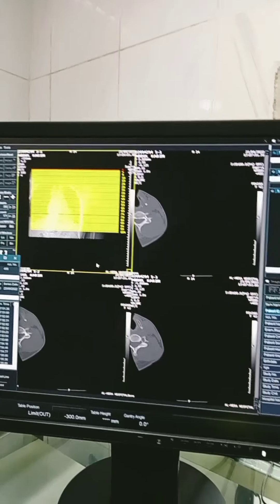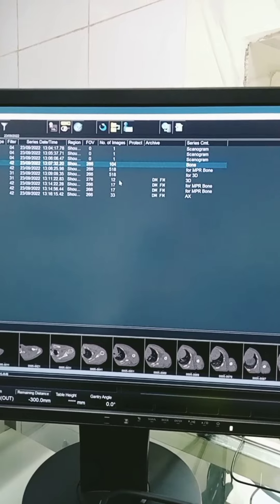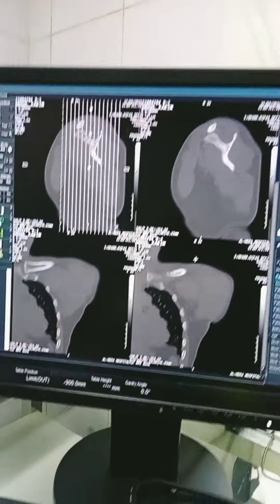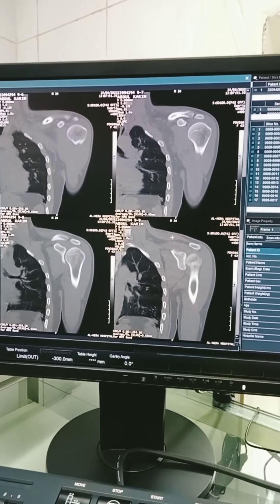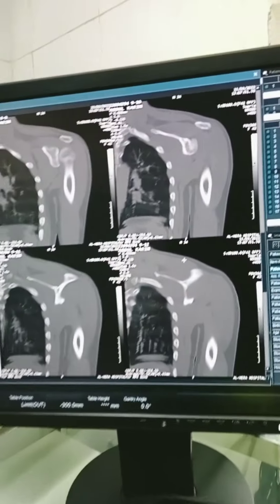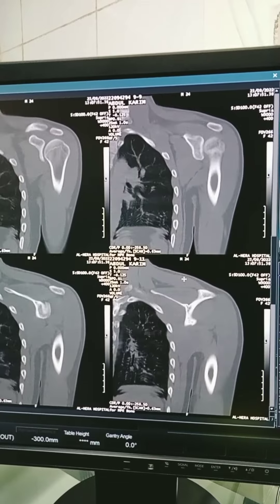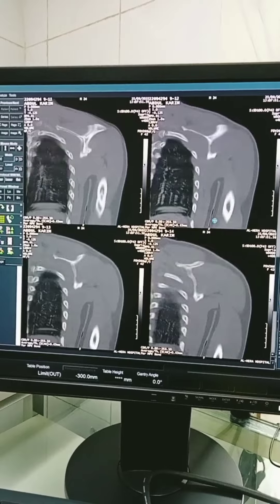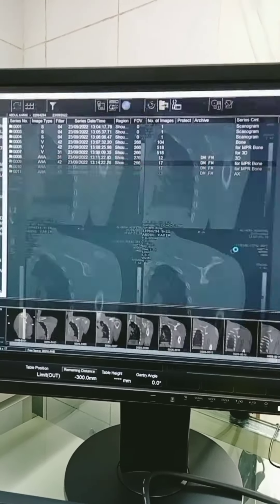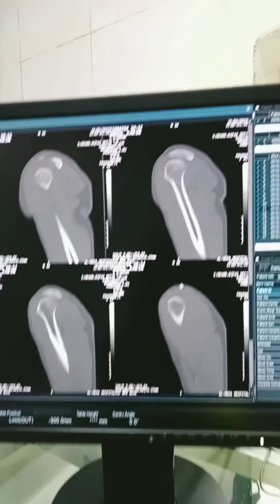The measurement can go. This is the coronal image of the shoulder joint. This is the sagittal image of the shoulder joint.